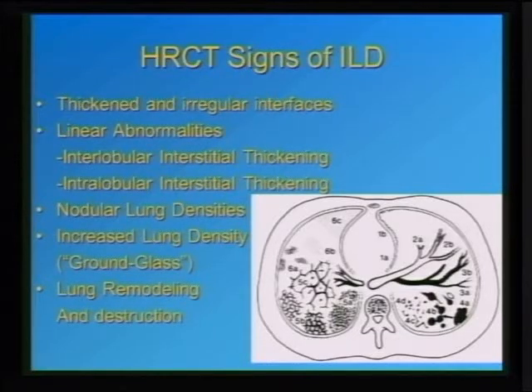One thing that is hard to recognize or hard to determine is the ground glass opacities. We know that both early airspace disease and early interstitial lung disease can give you ground glass opacities. But in the patients for which there is only reaction of the wall of the alveolar sacs and the different branching order of the respiratory bronchioles, it may be depicted as a ground glass opacity, but a true manifestation of interstitial lung disease rather than airspace disease.